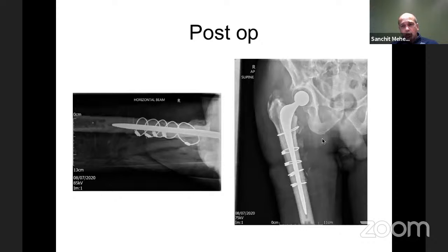So in this case, we chose to go with a long cemented stem, and this is the Exeter stem. Again, it restored the tube, but the advantage was that the stress riser is distributed a bit, plus the fact that we didn't have to take all the cement out meant that we could get away with a quicker operation. As you can see from the date, this is a fairly recent fixation. We did not have to change the cup, did not have to supplement it with a plate.